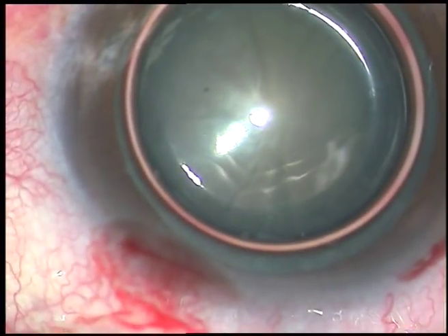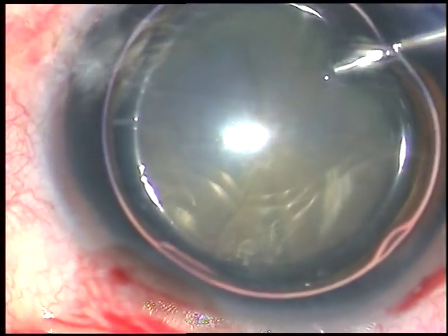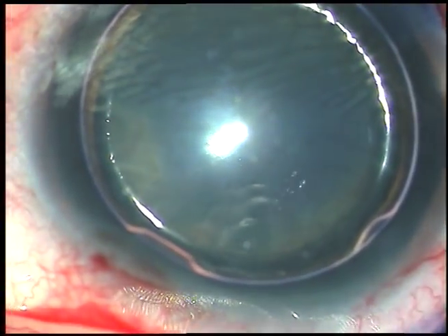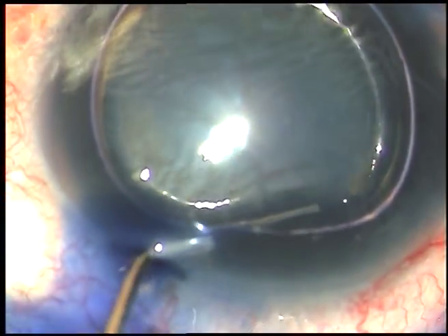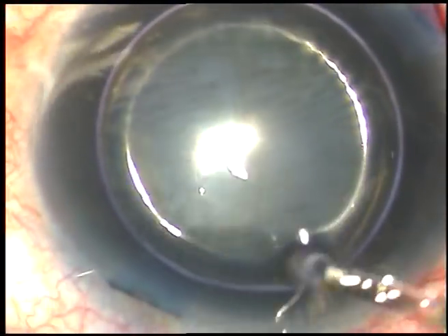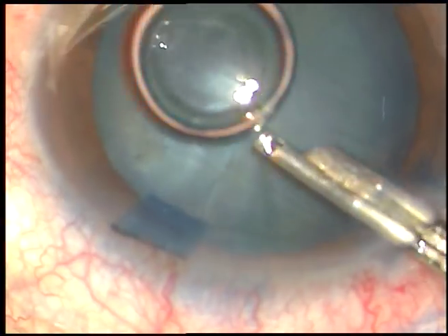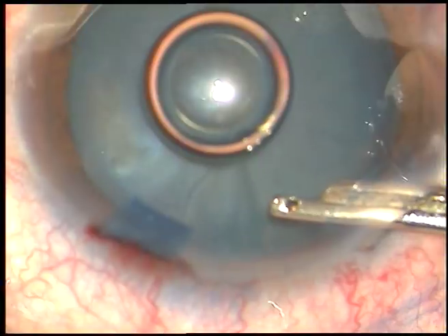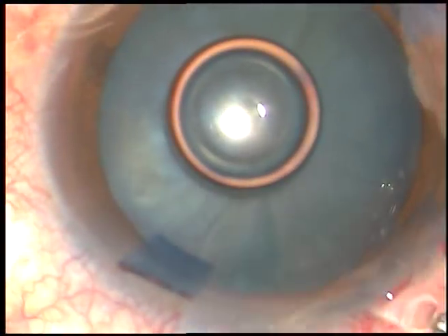By this time, all the incisions have been made. Now I am going to stain the anterior capsule with Trypan Blue dye, and I need this air bubble. The dye is sprayed on all parts of the capsule, and after 5-6 seconds the dye is washed out. There is uniform staining of the anterior capsule within this very short time, about 7-8 seconds.